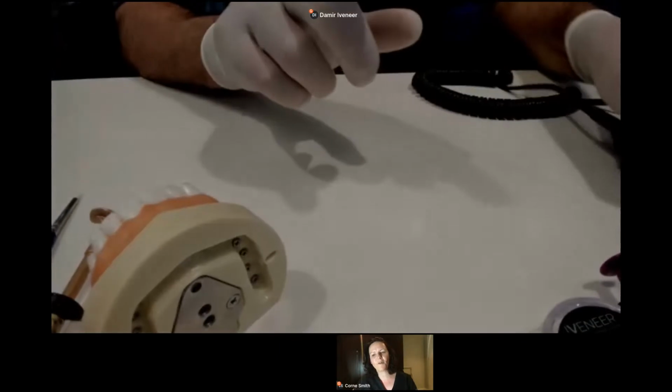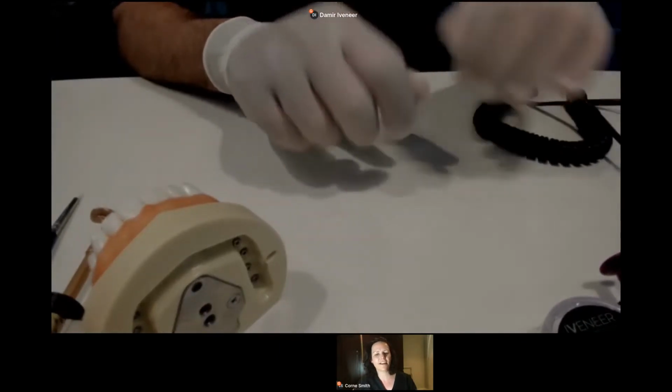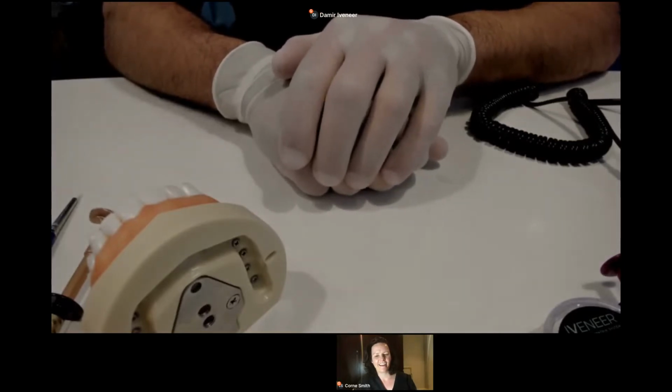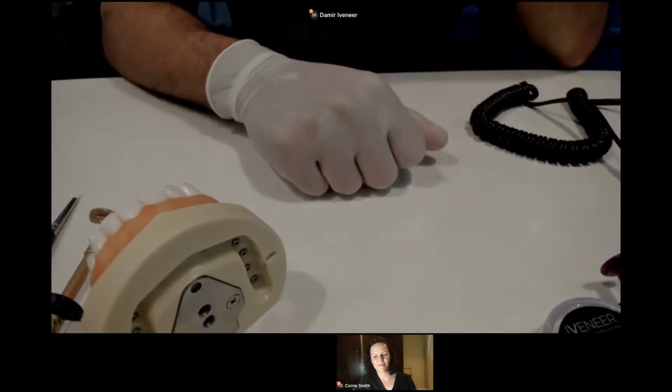We just want the lowers to be done. Just the lowers. You know, this is a tool. This matrix will give you 90%, maybe more, of the final shape. You don't have to deal with shape. You don't have to think too much.